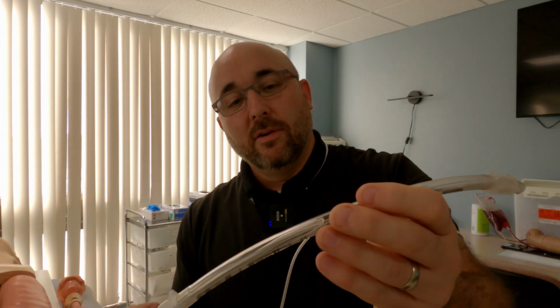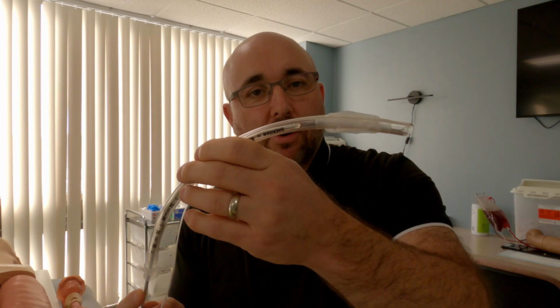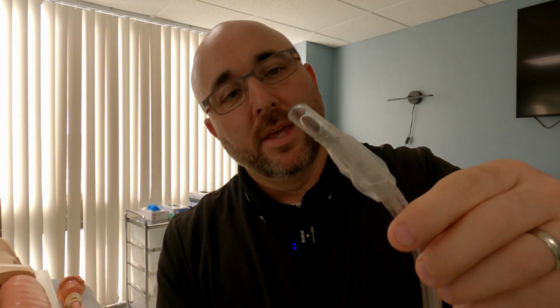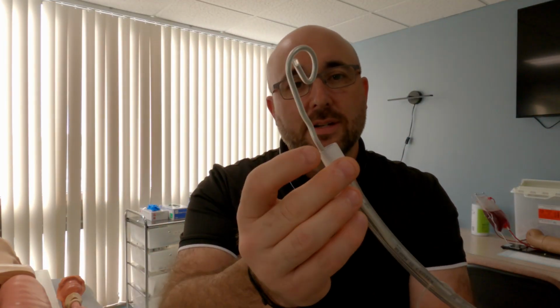So when we insert this stylet to prepare for everything that's going to be going on with intubation, usually you go about to this place right here. You see this hole here is called the Murphy's eye. And so you could get about to the Murphy's eye, which you can see right there kind of sticking out. I usually pull it back to about cuff level or so. And then once you're at that piece, you see we still have quite a bit sticking out.